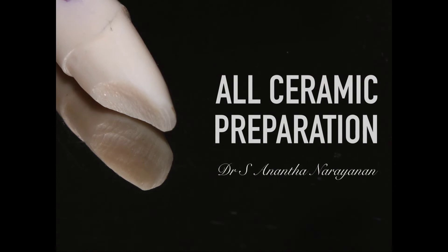In this video we'll be looking at an all-ceramic preparation done on a maxillary central incisor. The maxillary central incisor is one of the most common teeth to receive an all-ceramic restoration, be it e.max or zirconia. The success of the all-ceramic restoration primarily depends upon how well the preparation has been done, as it helps produce good aesthetics, durability, and longevity.